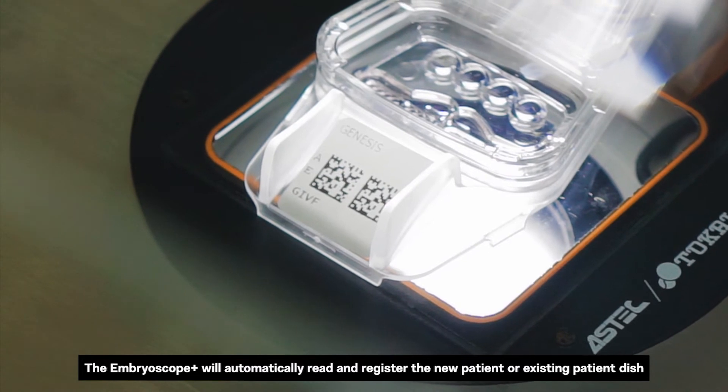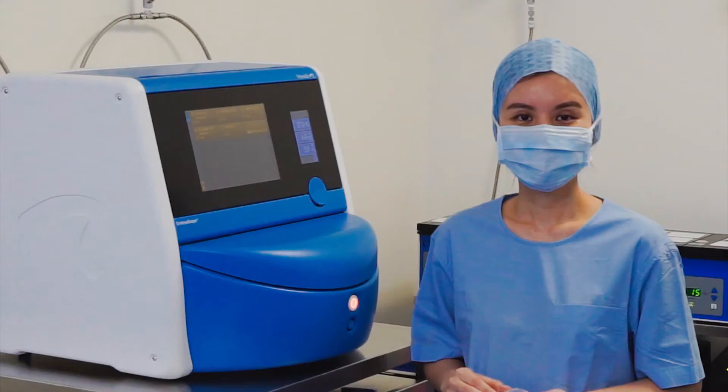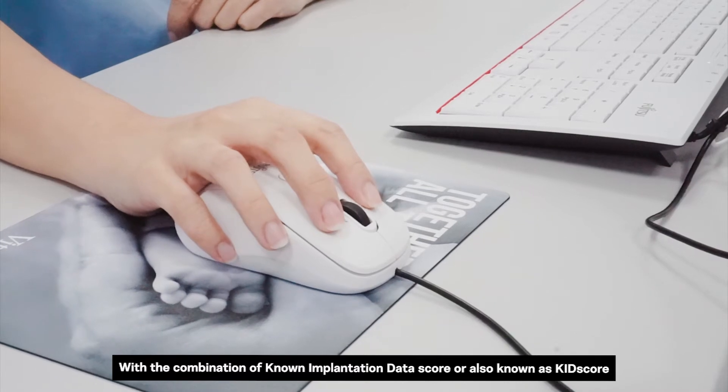Each patient has their own culture dish with an identification barcode system for efficient workflow. The Embroscope Plus will automatically read and register new or existing patient dishes. This design helps prevent any mix-up, since each barcode is specific to each patient.